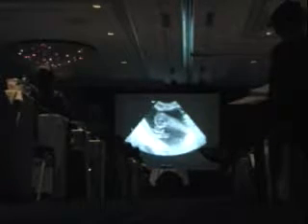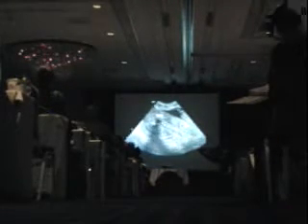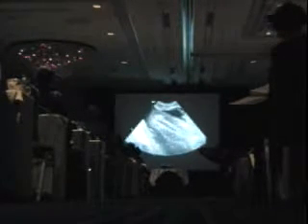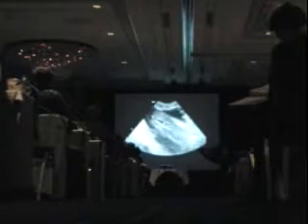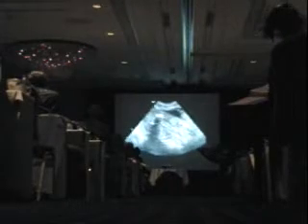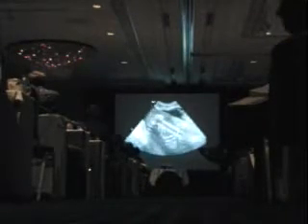Now, this is a flat defect, so if that one doesn't have a big cyst hanging off the back, it'll be a little harder to spot in some views. This one has the nice big cyst, so this one's going to be pretty easy to spot, plus a lot of times they do have polyhydramnios, which you can also identify. And here's just a clip showing you what these look like. You should actually look at the spine, look at sometimes a little bit of widening of the posterior elements. You can see the sac, the fluid collection in the back, and you can see the actual hole in the defect itself. So all these things can be appreciated.